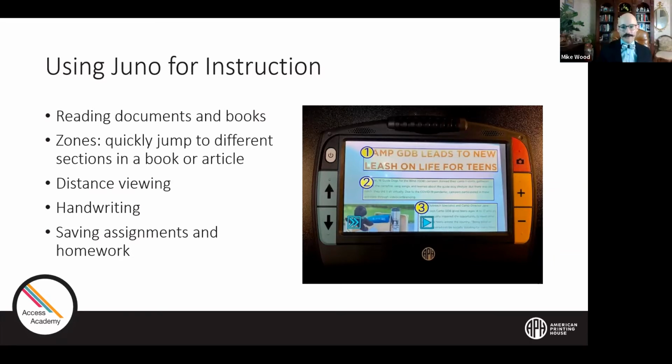So you could run the OCR and have it read it to you and then not save that file immediately, if it's something you don't want to store on the device. Exactly. If you're reading your mail or something and you don't want to save that piece of mail and have to go back and recognize the text, you can just instantly capture and then hit the recognize text button and it'll start reading to you right away. And then you can decide if you want to save it or not.